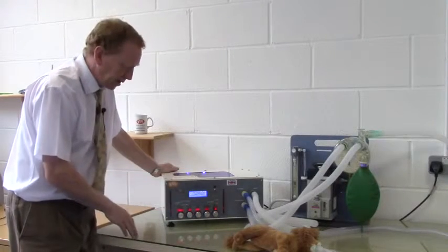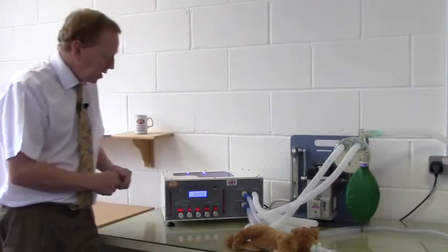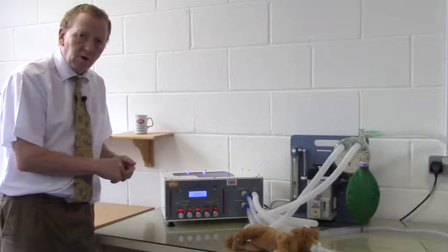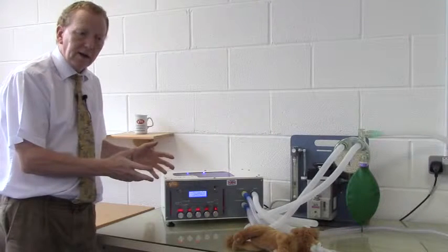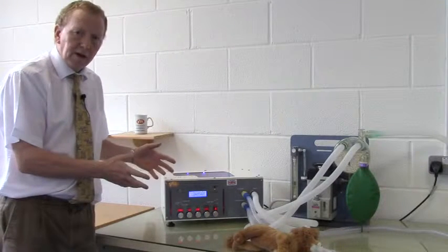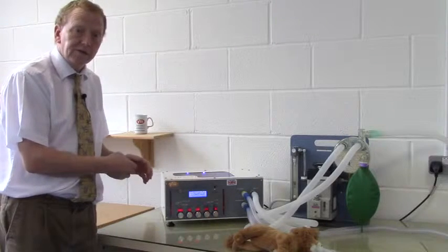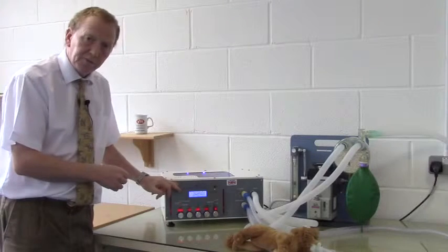Having set this configuration up and having the fresh gas flow set accordingly, at the moment I've got this running at about 1.5 litres, which is in excess of the requirement of a rebreathing circuit, but in the initial stages it allows the circuit to quickly raise the isoflurane or anaesthetic agent concentration, so I'll leave it at slightly higher for the moment. Now we just put the ventilator to run.